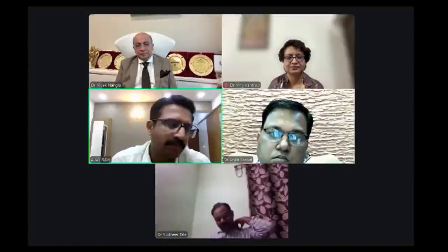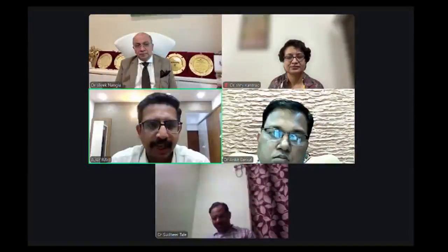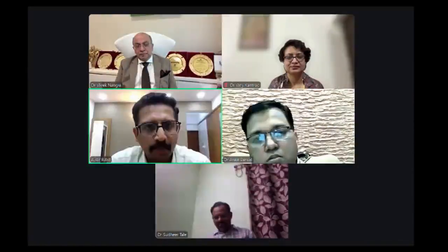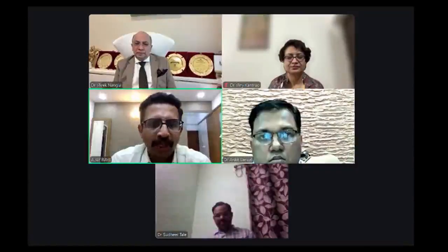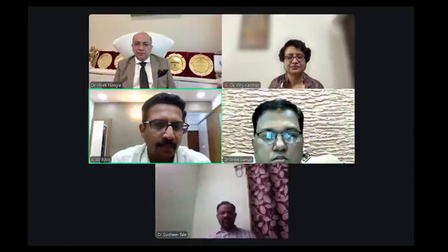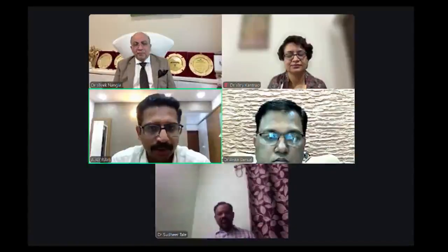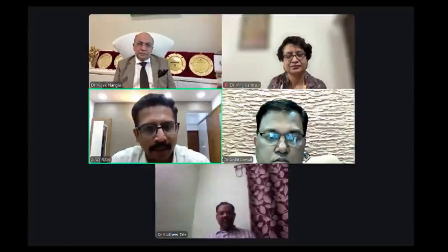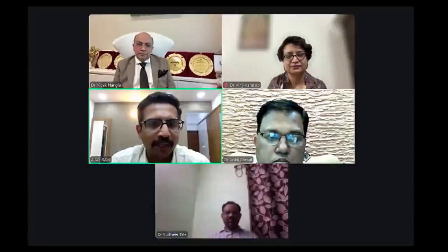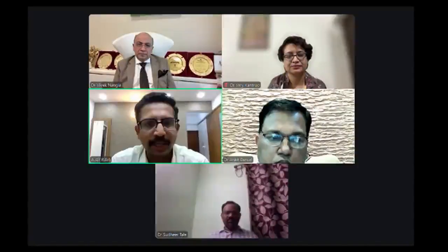Adequate size means, as I said in my earlier talk, 5 millimeters is said to be an adequate size of a cryobiopsy specimen. Why 5 millimeters? This corresponds to the field of area of a 4x microscope zoom. If you keep it in a 4x microscope zoom, the area it covers is approximately 5 millimeters. This helps pattern recognition in interstitial lung disease, because you are not going to see the individual small fields. Pattern recognition is very important when it comes to ILD, interstitial lung disease. That is about the size and number of specimens.